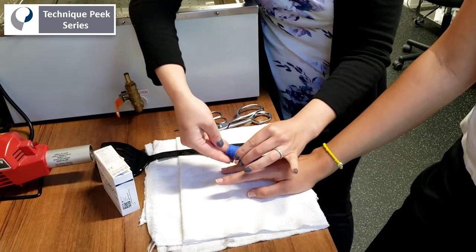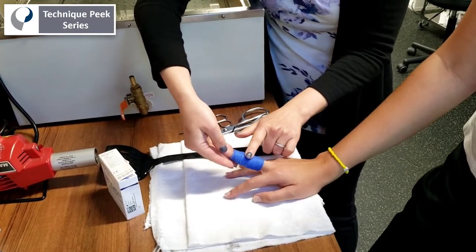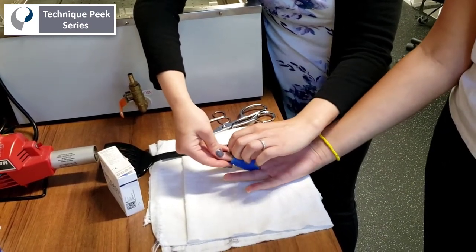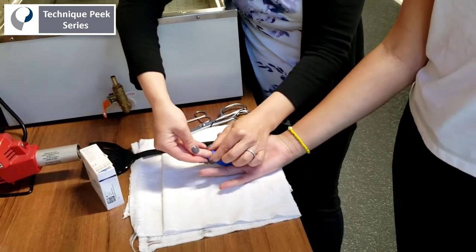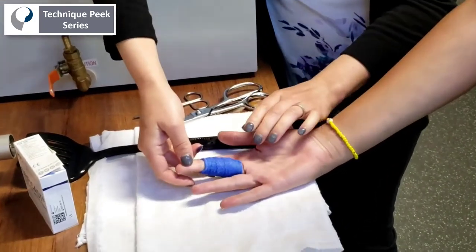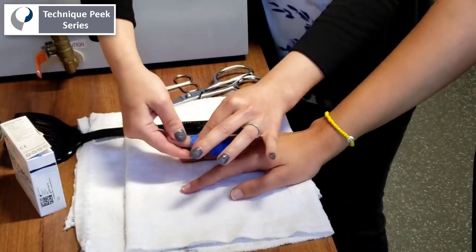At this point you can use the extra time you have while the material is setting to get your maximum PIP joint extension. You can turn the palm over and check that you have clearance at the DIP joint. If not, you can roll that material down a little bit. You want to ensure there's plenty of motion at the DIP joint to prevent ORL stiffness. It usually takes about a minute to harden.